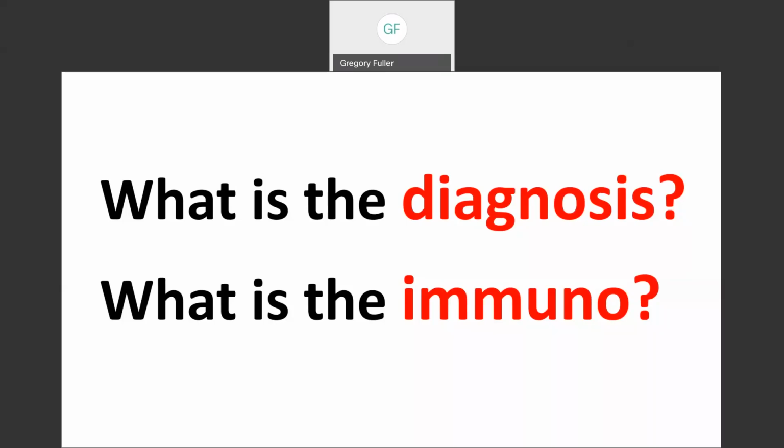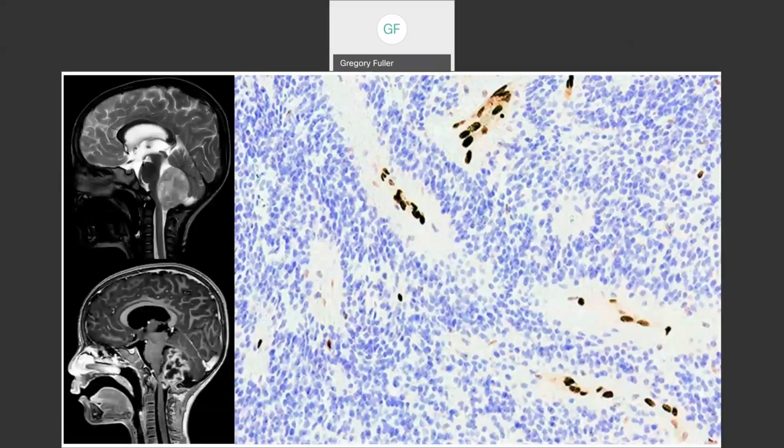I want to know the diagnosis, and I want to know the immunostain. Ready? For anyone who didn't see the conference, take a stab at it. I want to know the diagnosis and the immunostain.